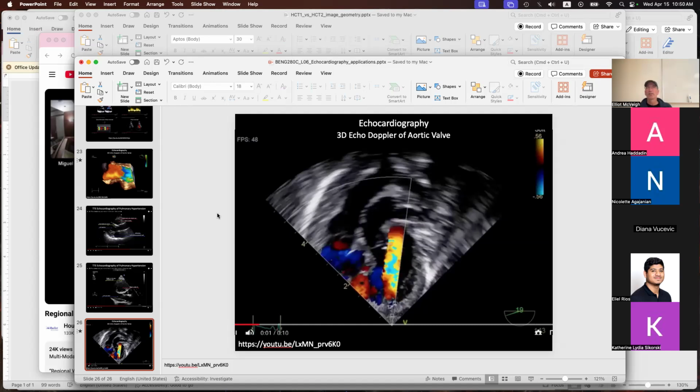So looking at projects, if anybody wanted to do a project on echo, one thing that it would be great to have somebody do is a really deep dive into fully 4D echo, modern 4D echo, where you use a phased array transducer that essentially broadcasts a plane of ultrasound into the sample and then receives this 2D by time signal back to reconstruct the 3D image and 4D image in real time from that entire signal.